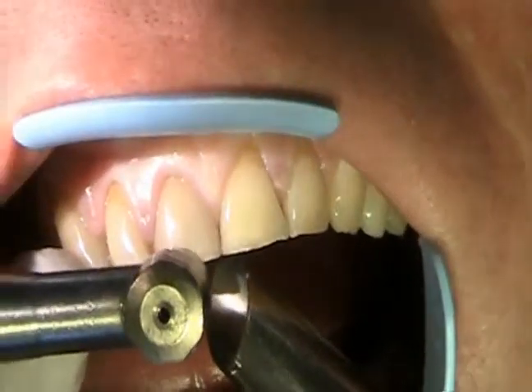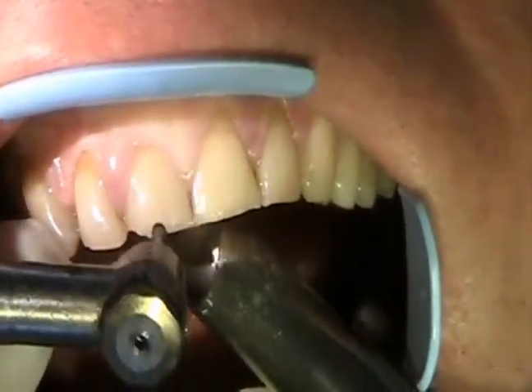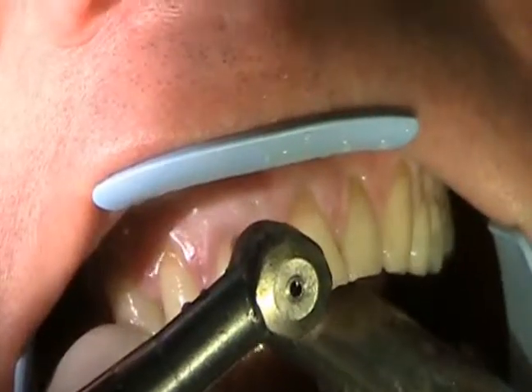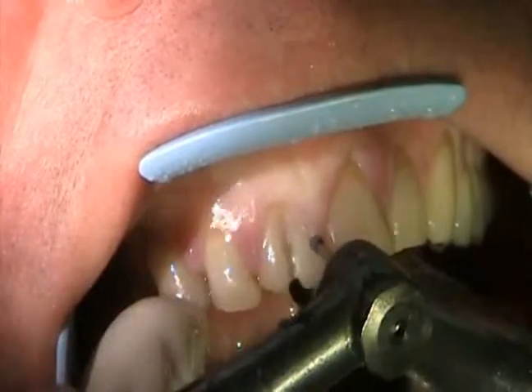To do an extreme smile makeover, we have to go ahead and prepare the teeth to accept the crowns. That means we have to remove the enamel surface from the teeth so that we can have some room to put the porcelain in, and you notice here we're making depth cuts in the enamel.